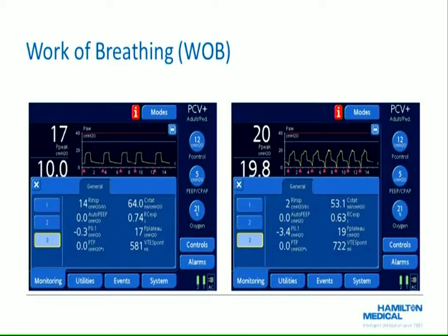By the way, these slides are made with this little port on the side; there's a thumb USB port underneath that, and all you do is stick a thumb drive in there and bring up on the screen whatever you want, and you press this button here that looks like a printer, and it writes a JPEG of that right to the drive. And so I just say, here's what these guys are probably going to want to talk about. I create the scenarios that go along with what we want to talk about, and so instead of having to fumble with, because you've seen operator error a few times here this morning already, we don't want to get caught up in that, right? So I just create the slides.